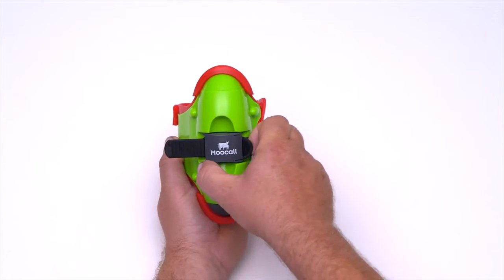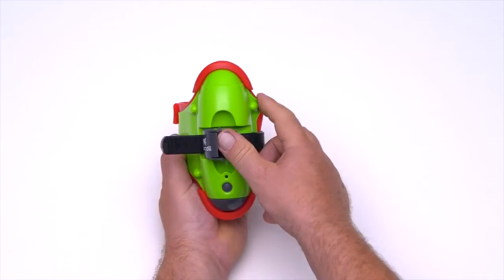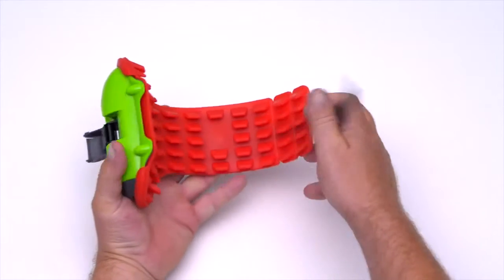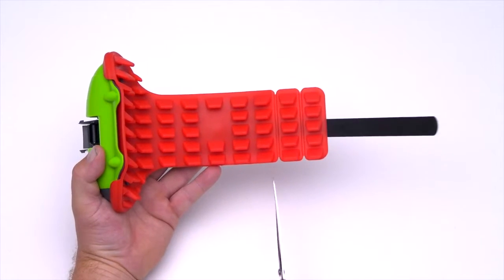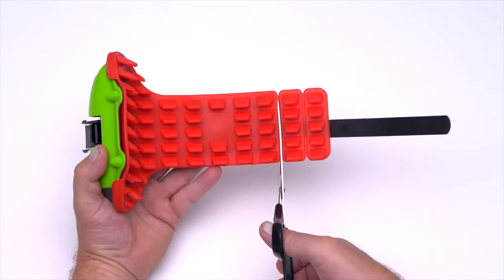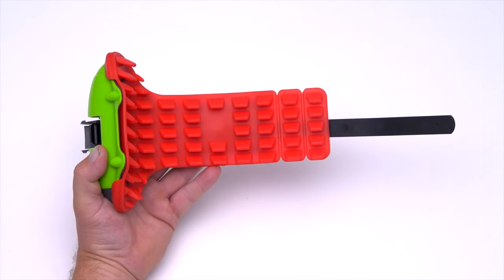To open the ratchet system, simply lift the ratchet paddle and push all the way to the left to release the toothed strap. Customise the red rubber liner for your herd by cutting at the selected points to suit the tail size on your farm. Your Moocall calving sensor is now ready for use.